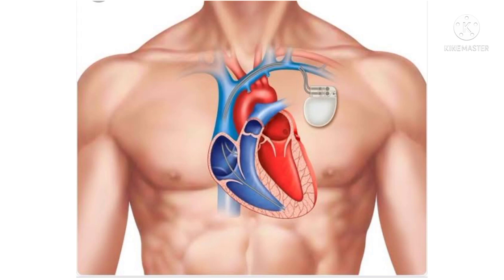Do not lift, push, or pull anything that weighs more than 2 to 3 kilograms, including children. Watch for signs of infection at the incision site: redness, swelling. Dressing: keep the incision dry for 1 week after the implantation. Avoid lifting the operative side arm above shoulder level until approved by the care provider. Avoid direct blows to the generator or large magnets such as an MRI scanner, as these devices can reprogram a pacemaker. Microwave ovens are safe to use and do not threaten pacemaker function.